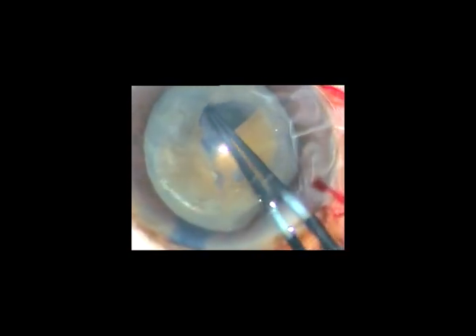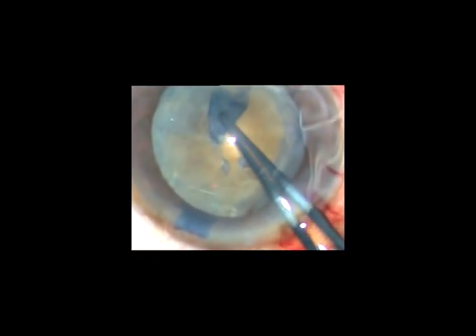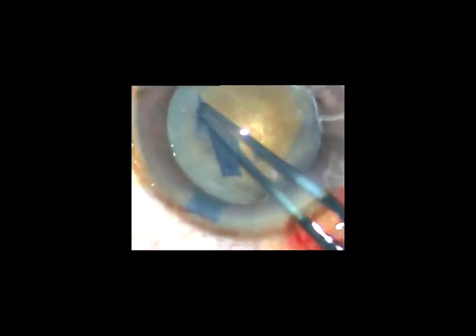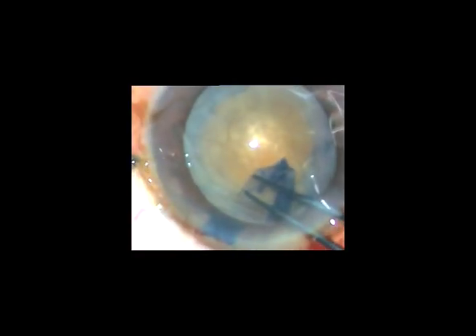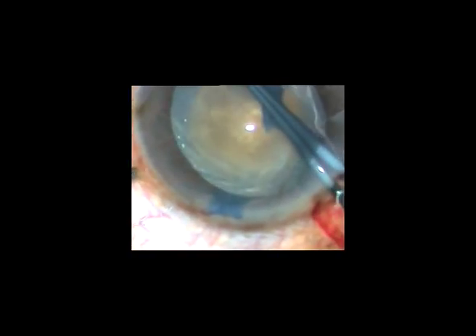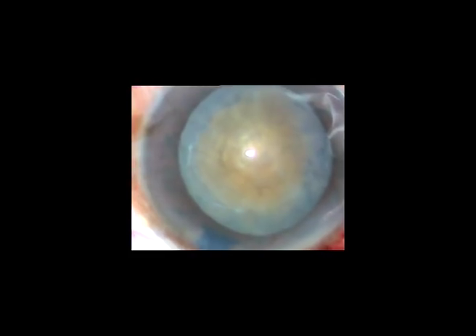In hypermature Morgagnian cataract, your pull should be very gentle and always watch the character of the capsule. Is there any wrinkling of the capsule? Are you tearing some zonular fibers as you are pulling the capsule? If you are tearing off some zonular fibers, be more gentle, be more slow, and complete the rhexis. Thank you very much for watching. Hope this will help you in your practice.